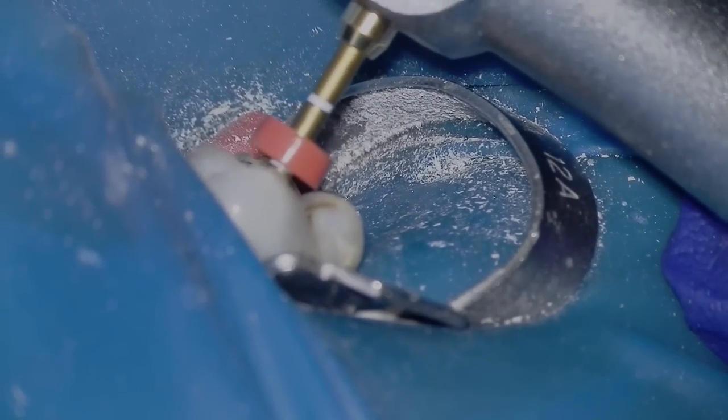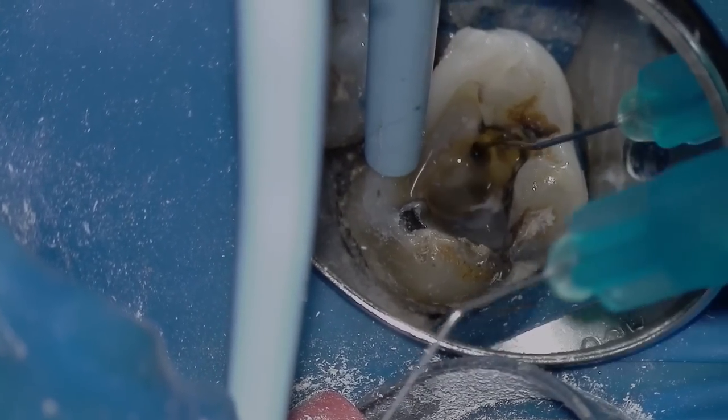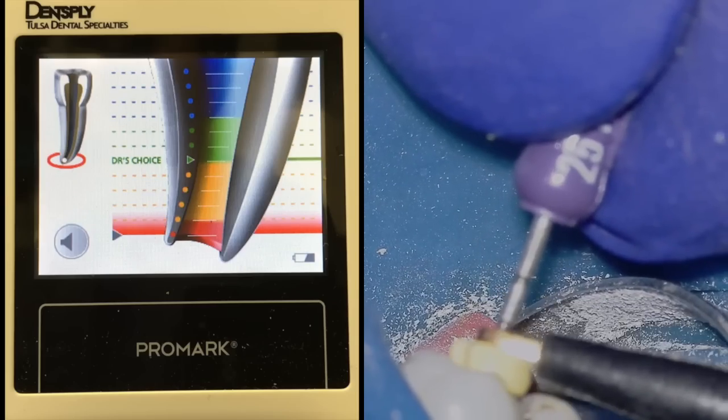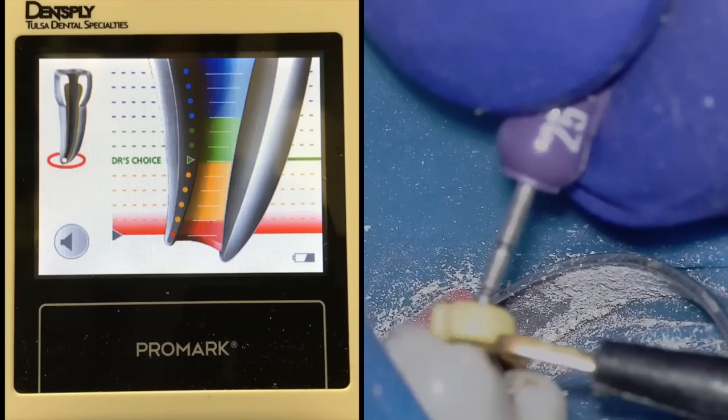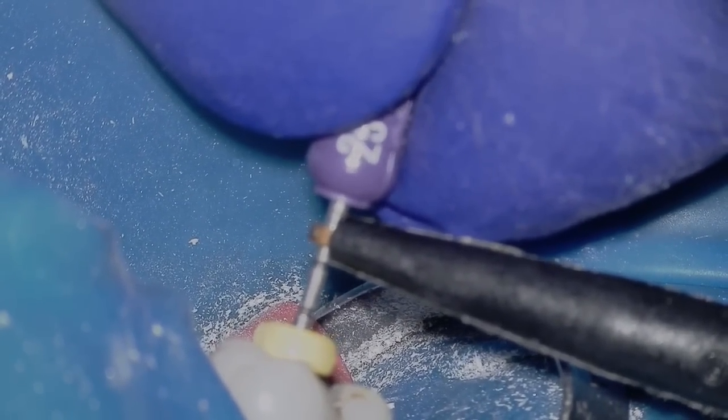I'm going to irrigate a lot and refinish cleaning and shaping MB1 and all the other canals as well. This is a side view showing with a microscope how accurate you can get with your rubber stop. After I do the WaveOne Gold Primary I recheck my lengths, because I usually find that I lose approximately a half millimeter to a millimeter in length depending on the length of the canal.